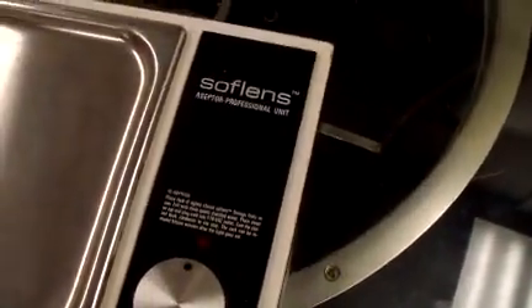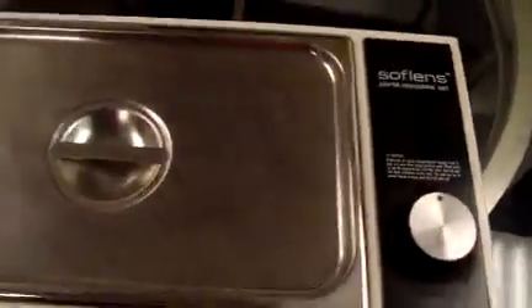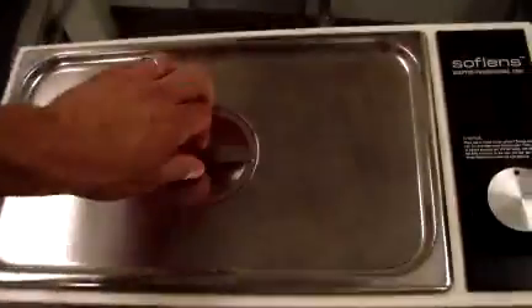Hey, it's Keith from DCSP Medical. We're looking at a Bausch & Lomb SofLens Aseptor unit. It's in good cosmetic condition.